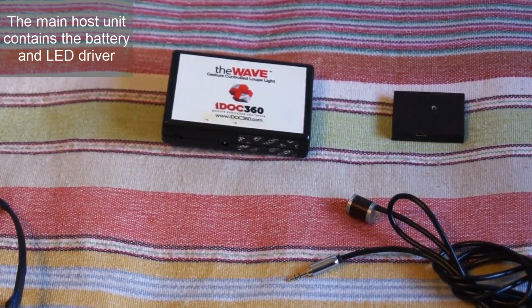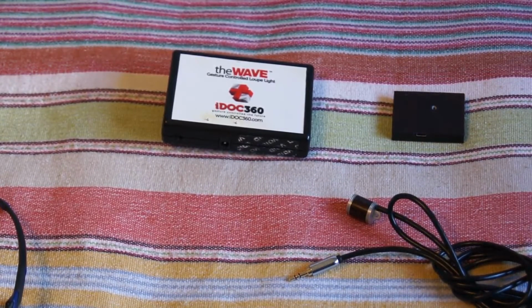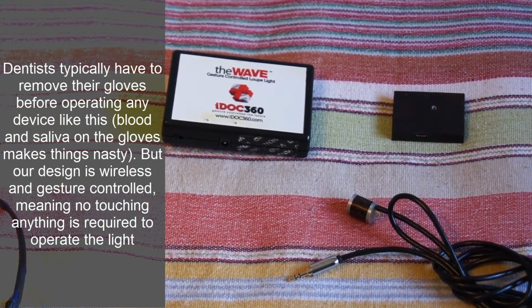Now this already exists on the market, but nothing like this one, because of the problem this solves. Typically when you operate this thing, the dentist will have to take off their gloves because the glove is probably covered in spit and blood and stuff, and it'll get that thing dirty, and you don't want that.